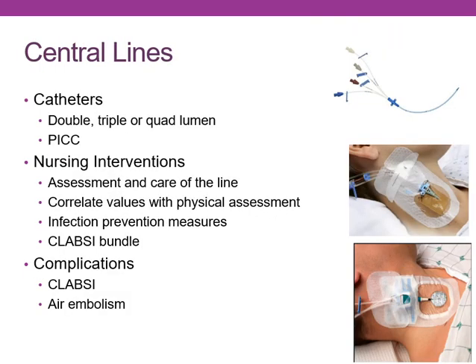Okay, so just a quick note on central line. We're going to talk more about this with DCing them, risk for air embolisms with your TPN and contents. But with central lines, you can have a double, a triple, or a quad. This is actually a quad lumen. So we have a white port, gray port, brown port, blue port. Up on them, it does tell you what this is. This is medial 2, this is distal, this is medial 1, and this is proximal, and that is how we chart them and not colors.